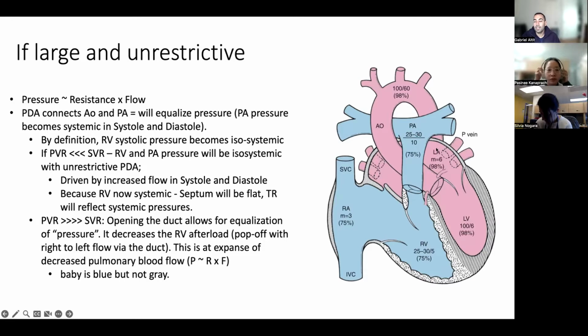And then the last thing is, let's say your LA is high also, you go into the LV and you can see what the LV pressure is. If the LV pressure is very high in diastole, where usually it is very low, it could be because you have LV remodeling, so hypertrophy, cardiomyopathy. You can have significant LV dysfunction. If you have significant systolic dysfunction, eventually the LV has difficulty emptying, so it's still overfilled when it's time to empty. So the LV end-diastolic pressure may rise.